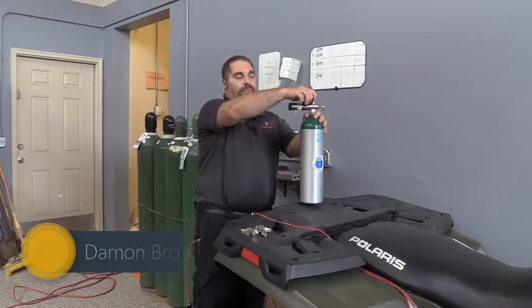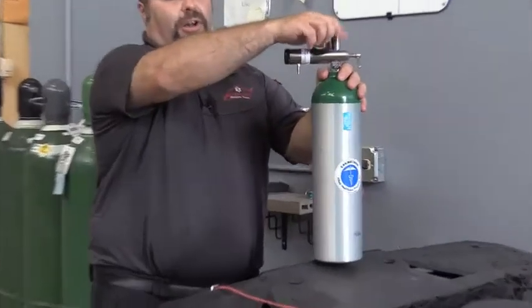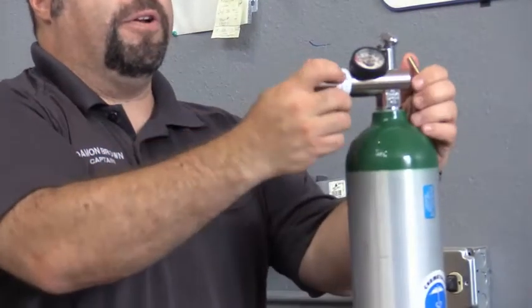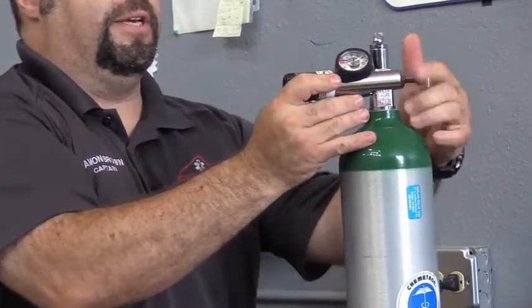First thing you're going to want to do is actually make sure that the bottle you want to fill is turned off with the top valve, and then you're going to need to remove the regulator. So go ahead and get that off.